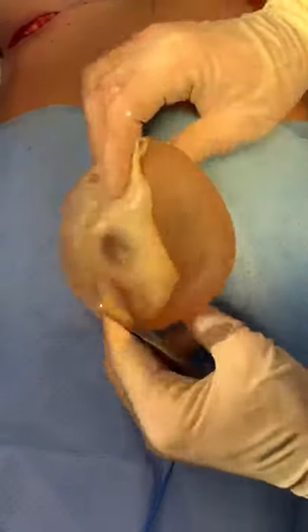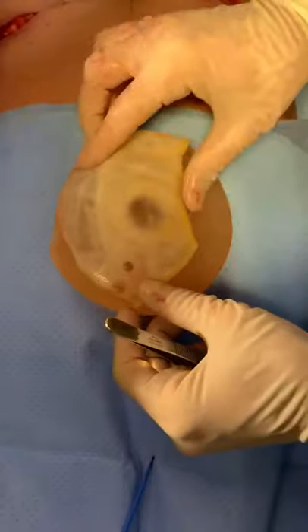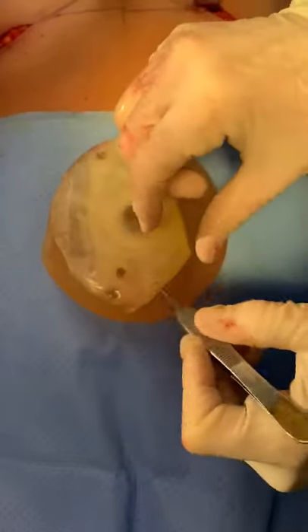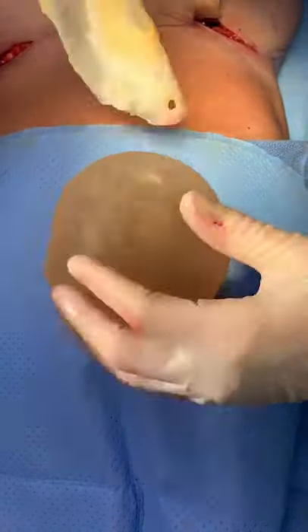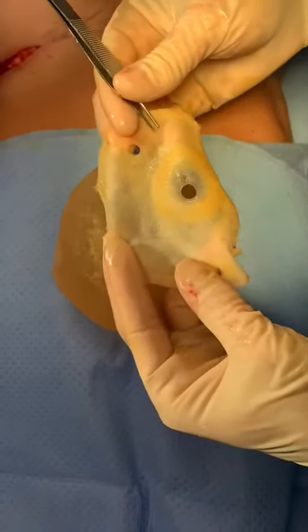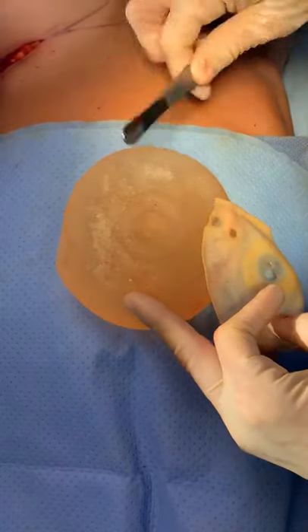Here we are with the backside of this old textured shaped implant, and we have a bit of a double capsule here. You can see and even hear that velcro effect from removing the body's natural scar tissue from the back surface of that implant.